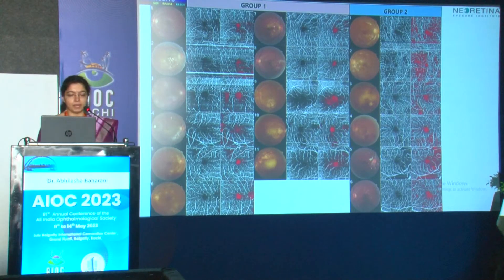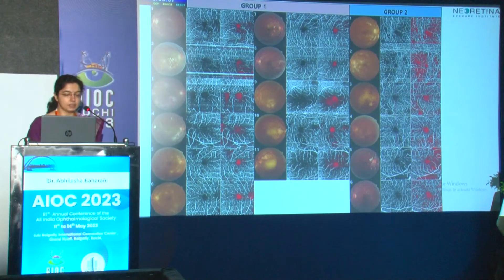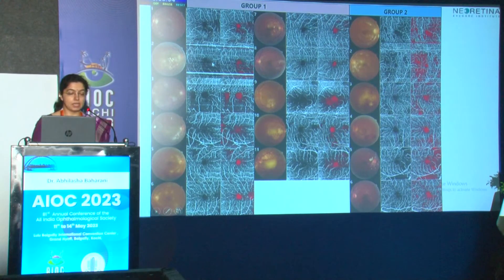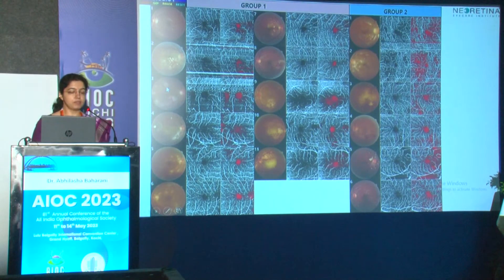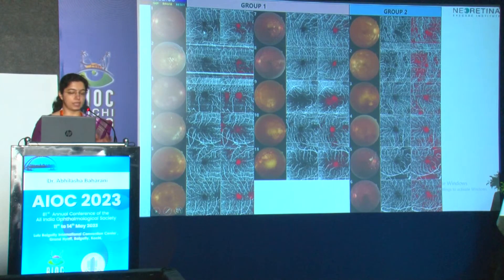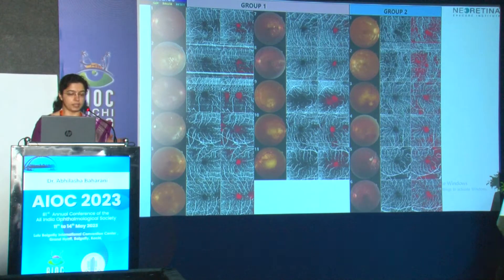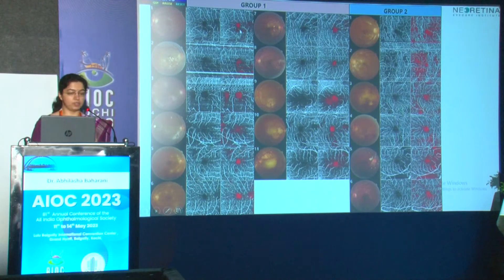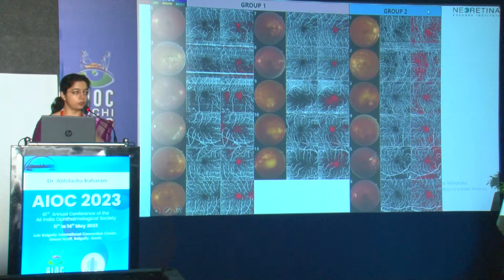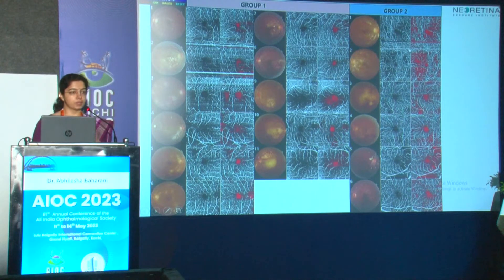I have also applied this in my cases of rickettsial retinitis, which I presented just this morning. The first panel shows the fundus photographs, and post-healing this is the OCTA scan of the superficial capillary plexus. These areas of ischemia co-localize with the areas of retinitis. Using the threshold function, you can quantify the ischemia and compare between two groups — Group 1 is the doxycycline group and Group 2 is the steroid group. We can objectively compare that the steroid group has more ischemia, and we have applied the same threshold for both groups.